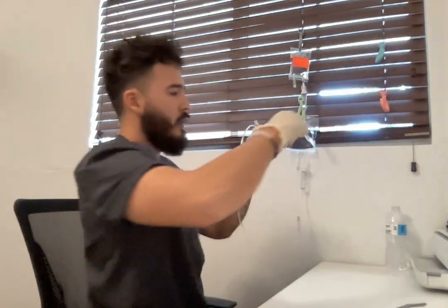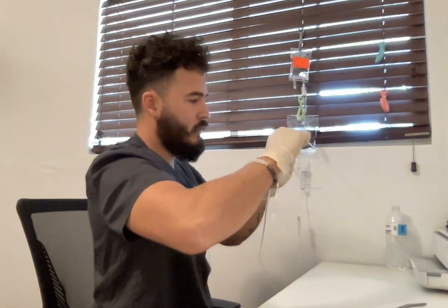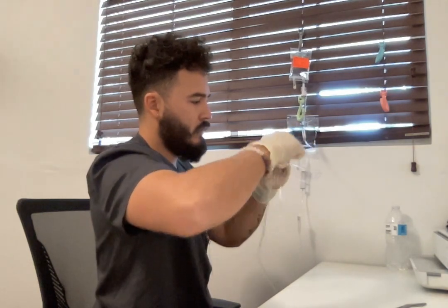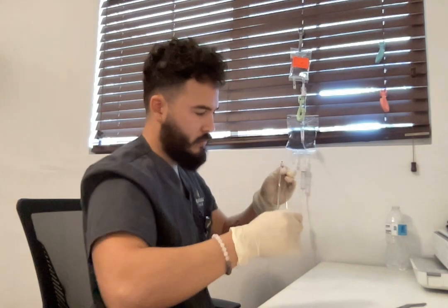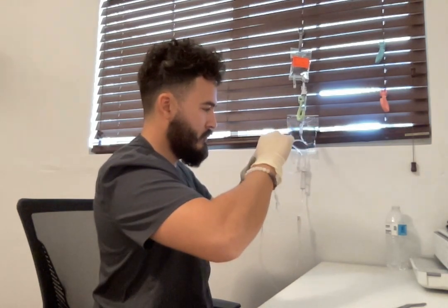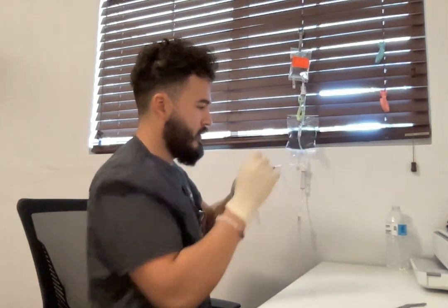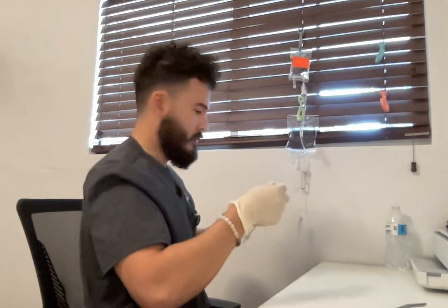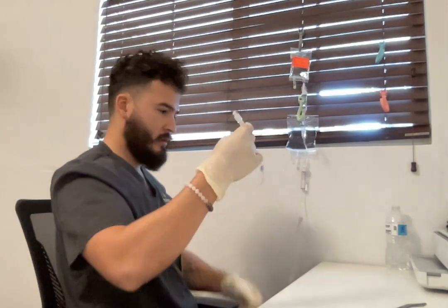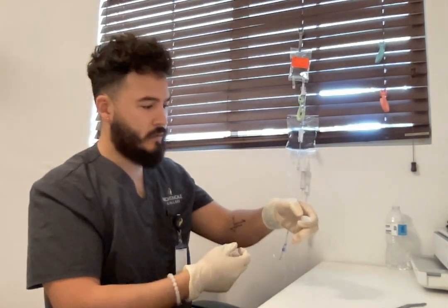And then get our medication line. Unclamp. Twist, connect, and then connect it into the patient's IV site.